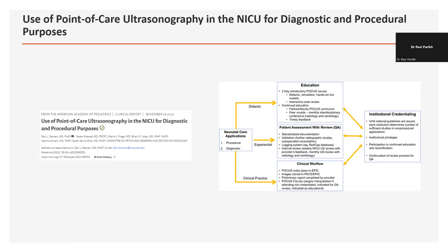That's really important. The reason I say that is that if you're performing a lung ultrasound for RDS and you suddenly change the frequency of the probe that you're using between scans before and after, because it's two different individuals doing the scans, you might end up with very different interpretations of how you might want to treat that. Now, that's not going to be good for the baby, but naturally, when you peer review, you might find that you may have been making different decisions if you'd used the right scan settings or the scan settings that were used by the individual either before or after.